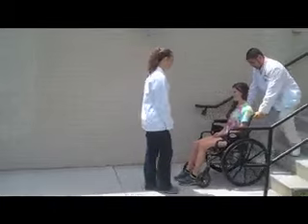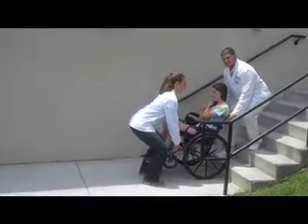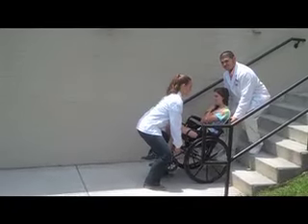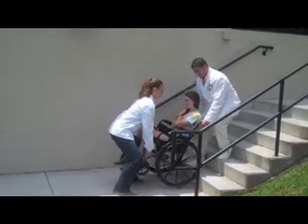Additional people should grab the frame of the wheelchair and not the removable parts such as the armrest or front rigging. With the drive wheels close or in contact with the bottom step, the clinician grabs the push handles and tips the wheelchair into the wheelie position. This wheelie position should be maintained while the chair is moved up the stairs.